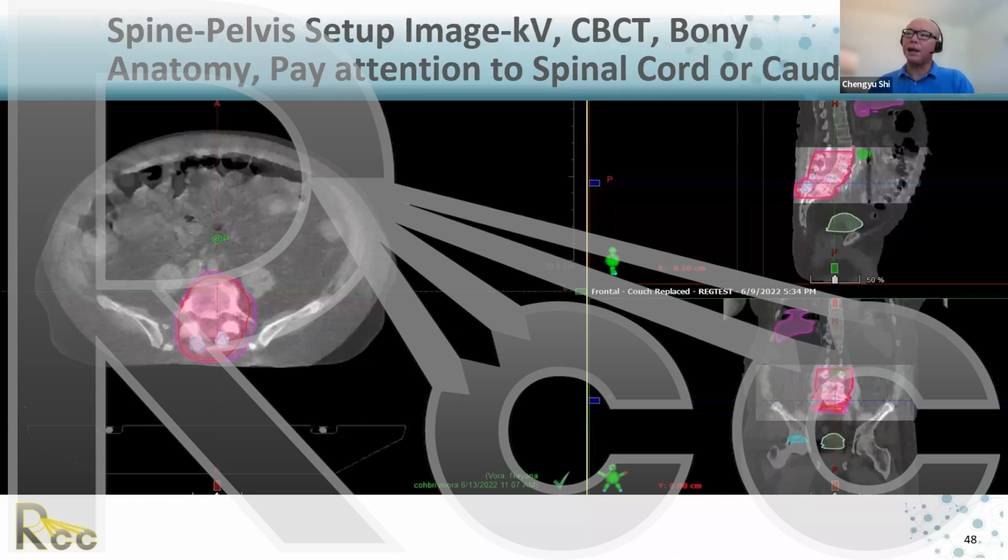Here's one topic corresponding to the previous question. The patient may have spine screws, the titanium screws. And if you know the materials, assign the corresponding Hounsfield unit. For photon VMAT, actually, it's not that bad. The dosimetric accuracy is okay, especially when you have the calculation ability. If you use static beam IMRT, try not to shoot directly through. Exit dose is okay, all right?